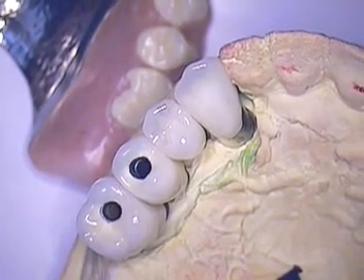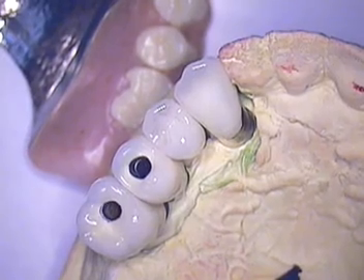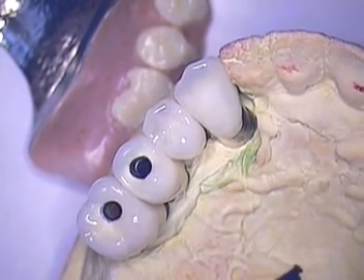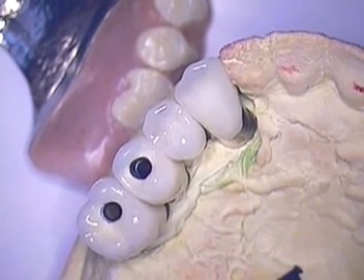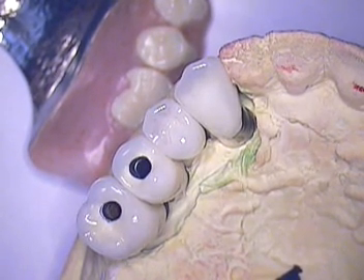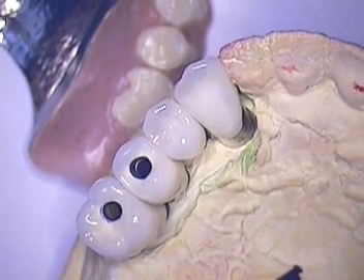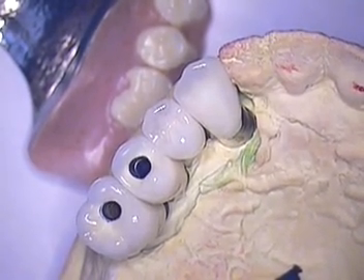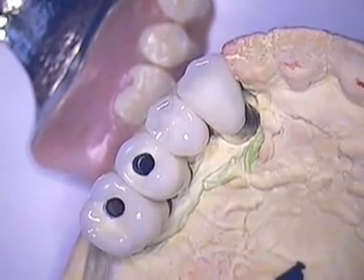Hello everybody, this is Dr. Jerry Cuomo again with another case. This case I pre-recorded earlier with a combination of cementable and screw retained implant crowns. Basically, this was a patient that was wearing a partial denture — this is the partial denture that he was wearing.